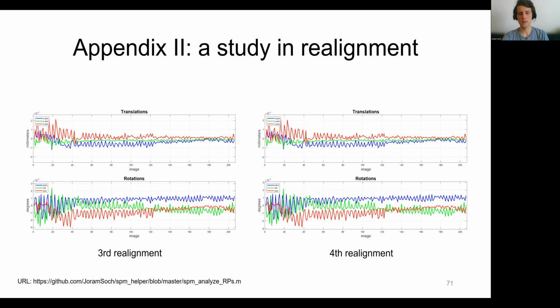And I think the little variations that we still see here are simply due to the fact that we are not measuring continuous time series, but that we are only measuring the time series of activity and of movement at every 2 to 3 seconds, depending on which repetition time you're using in your functional MRI session.